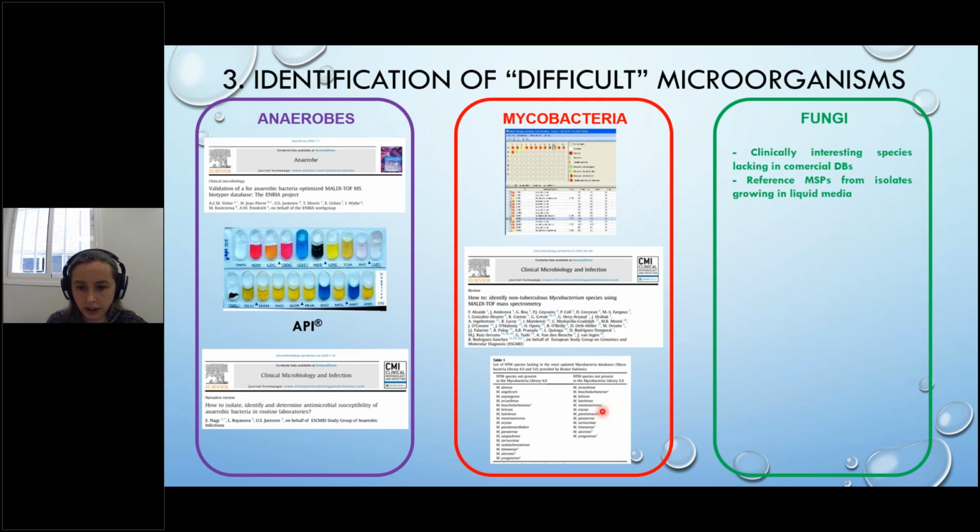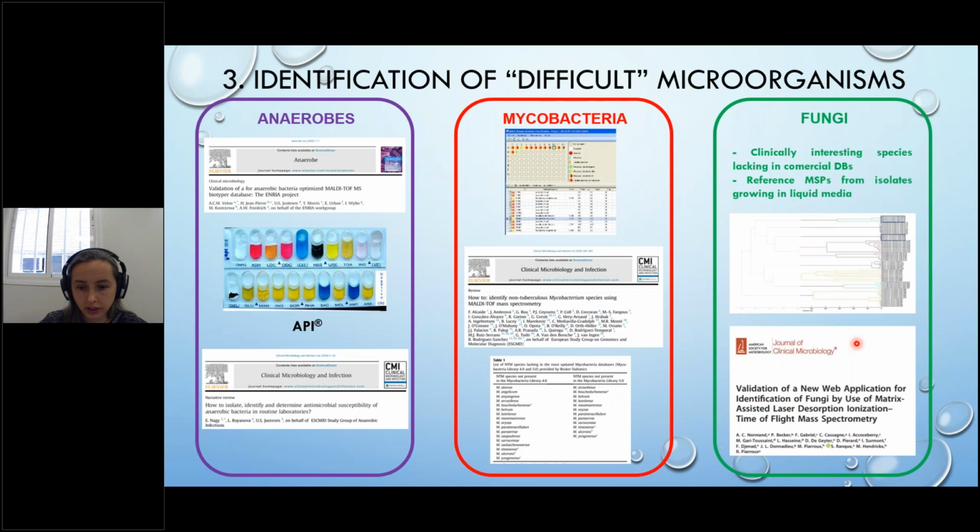So in this case, different laboratories made the effort to create reference protein spectra, and they built their own in-house databases. And it's outstanding.